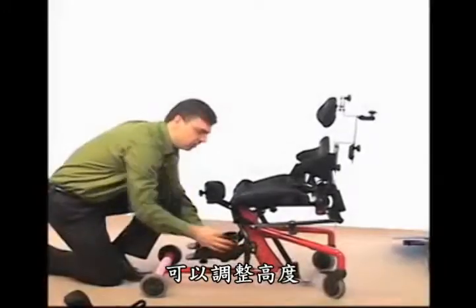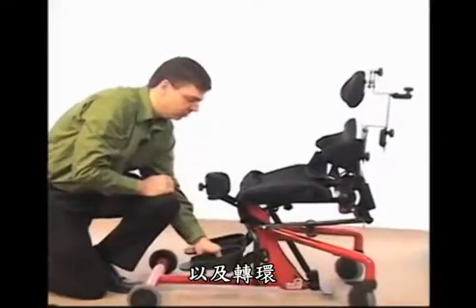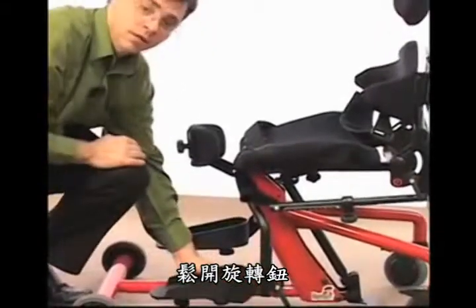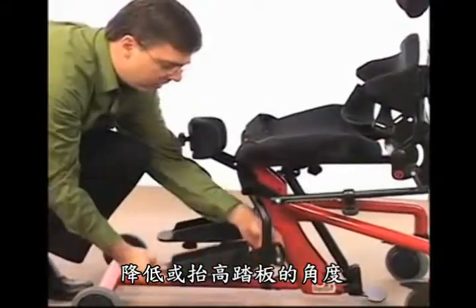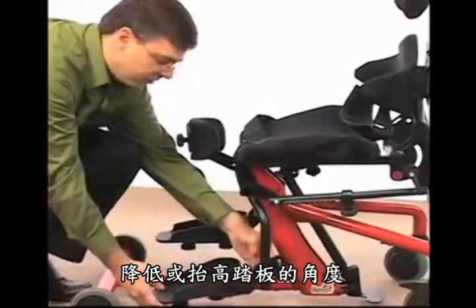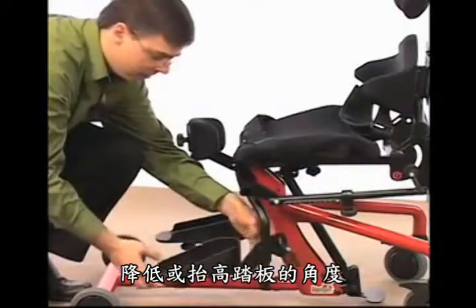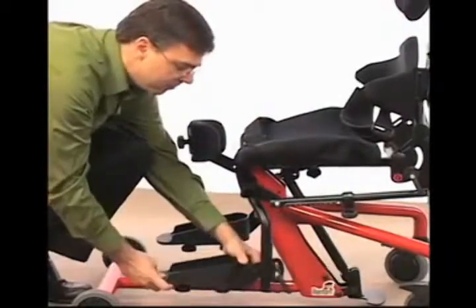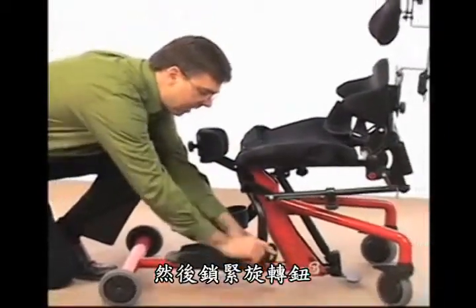The standard foot plates are adjustable in height and swivel. To make the adjustment, loosen the knob, then lower or raise and angle the foot plate as desired. Remember to leave the femur resting flatly on the seat. Then you can tighten up the knob.